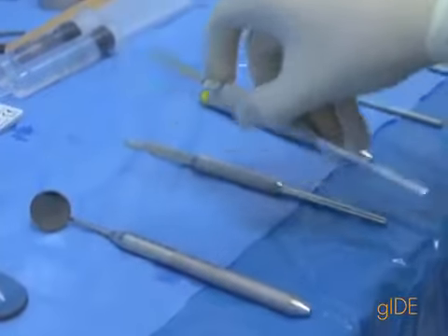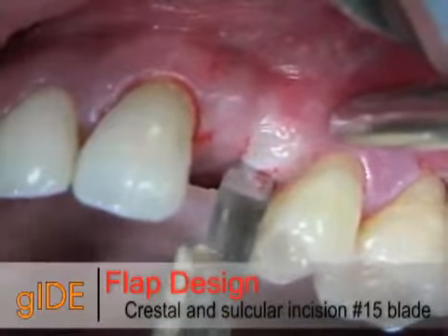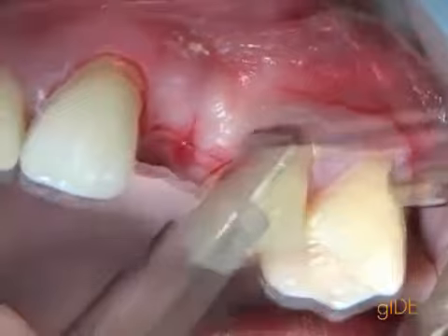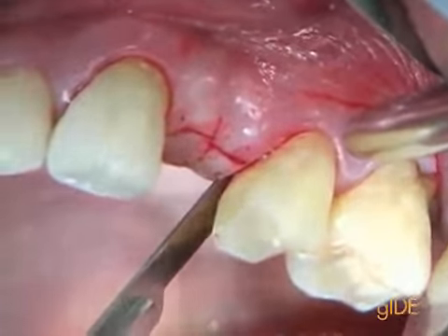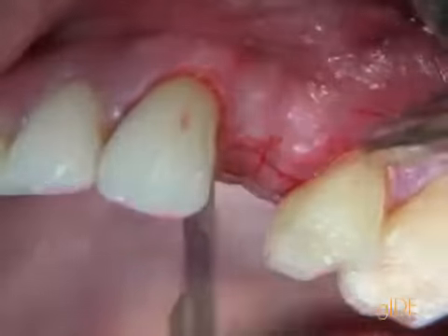The first incision is applied using a number 15 blade going through the crest, then going through the buccal sulcular, through the palatal sulcular, the other adjacent tooth going through the buccal sulcular and the palatal sulcular. Very precise and careful incisions are made.